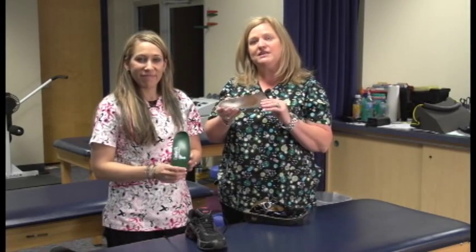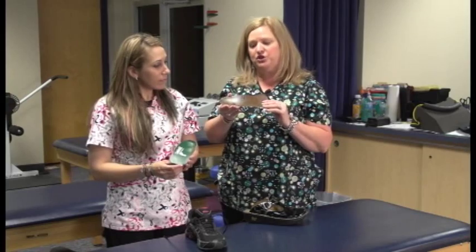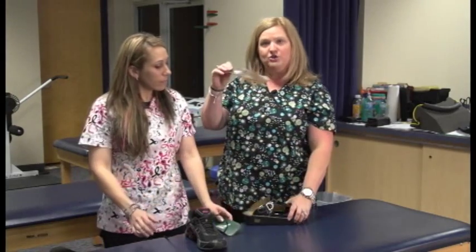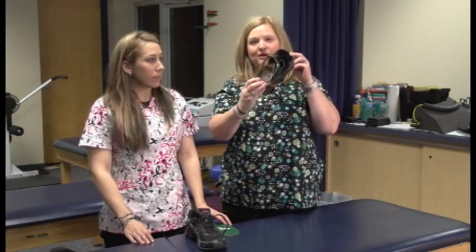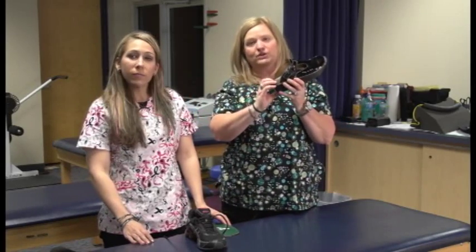An orthotic is a custom-made insert that would go in the shoe. This particular thin one would go more into a dress shoe. A patient can just slide it in their shoe, and in an open back shoe like this, they could use Velcro to hold it in place.